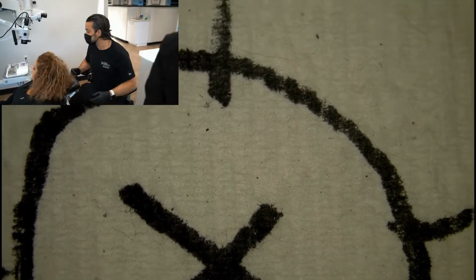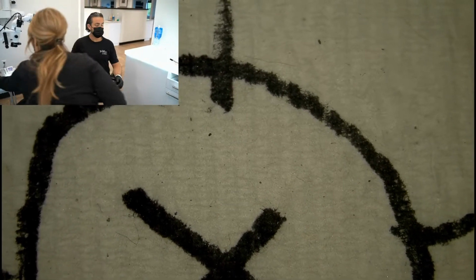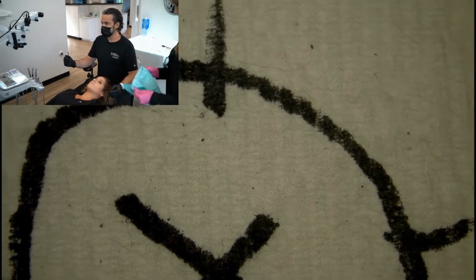You can just use that over there. You want to get a patient napkin too? Alrighty. Good old mirror and explorer.